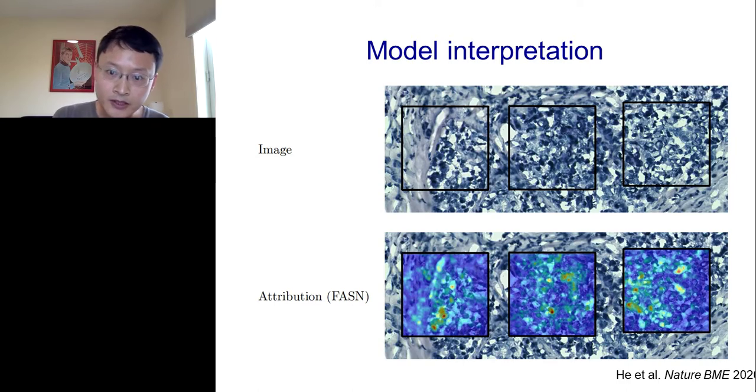And it's quite interesting because here the algorithm learns to focus its attention on relatively few locations in the input, which correspond to enlarged nuclei in the cells. So the parts where it's paying large attention, the red regions, correspond to these nuclei regions.